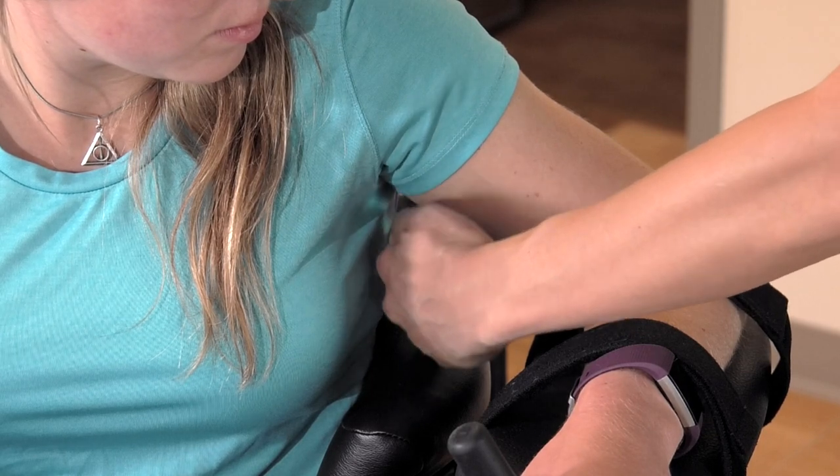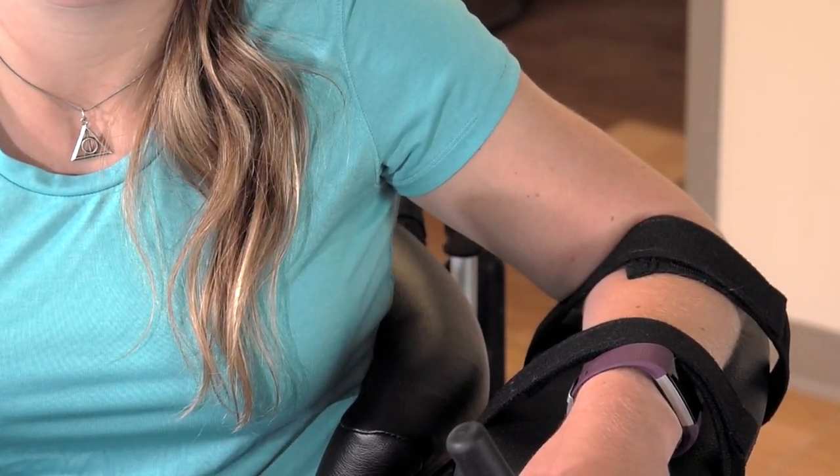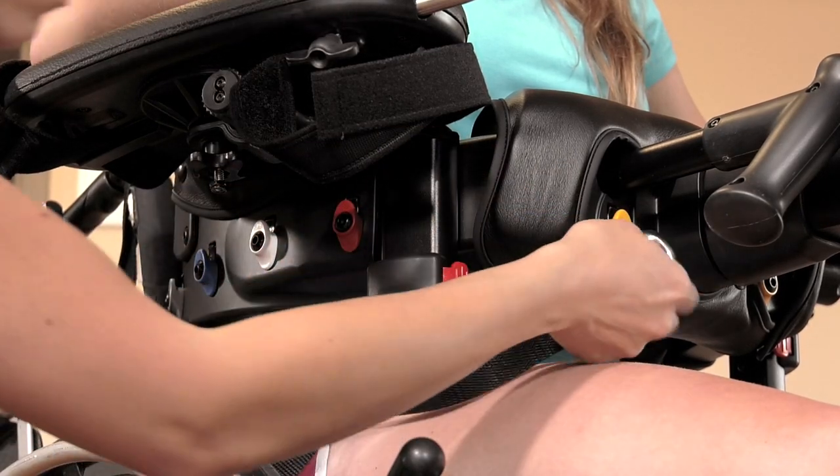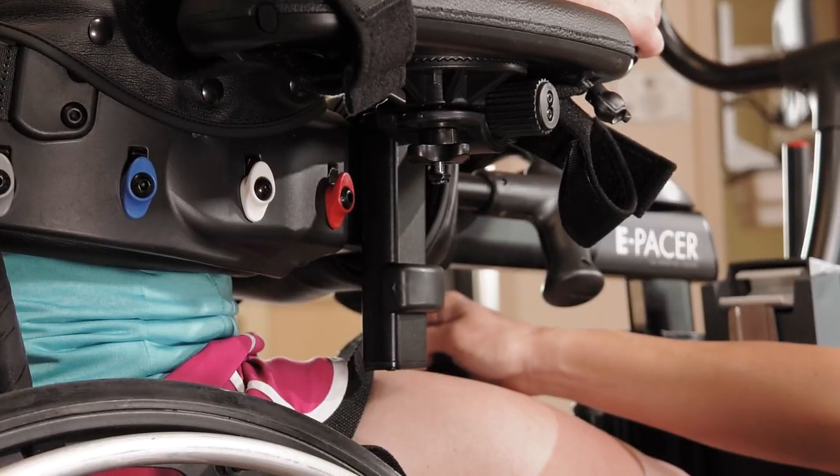There should be at least two inches of space between the top of the body support system and the armpit. Bring the silver rings at the end of the posterior strap forward and hook them onto the colored clips on the body support.